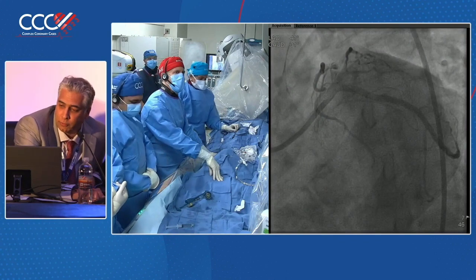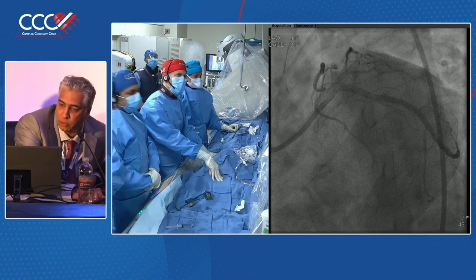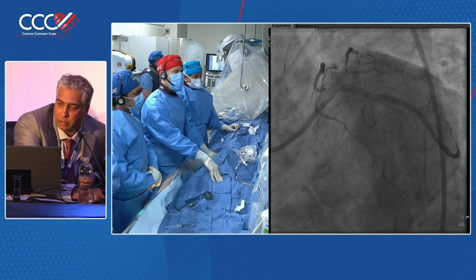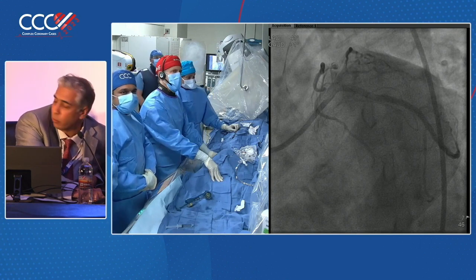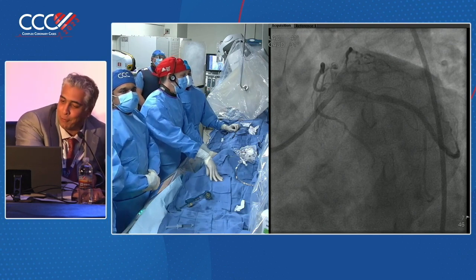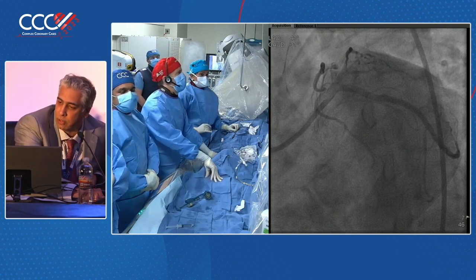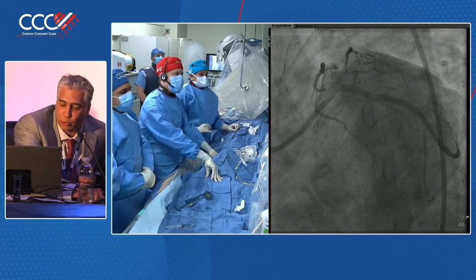No, I would, and for another reason, that the distal left main angiographically seems relatively free of disease, but it's really important to understand how much plaque is there. It may change your strategy in terms of stenting across. But otherwise a two-stent strategy with the diag seems appropriate. I know Dr. Stone and I go back and forth. Everything you do, you have to consider potential risks, and placing imaging catheters in certain cases can be more challenging and add time and potential risks, but certainly not in a case like this.